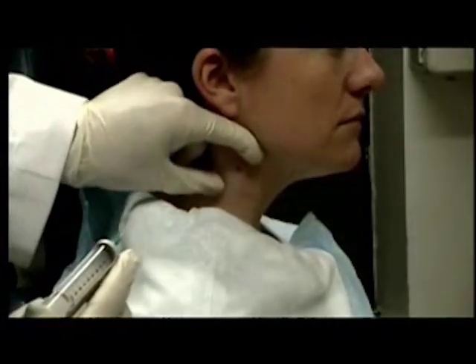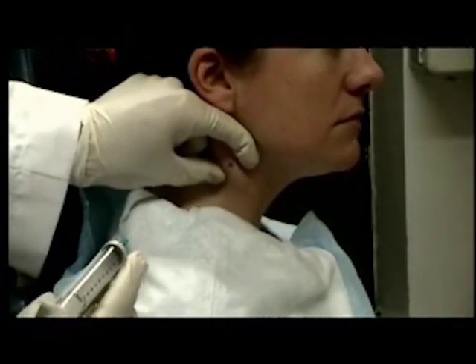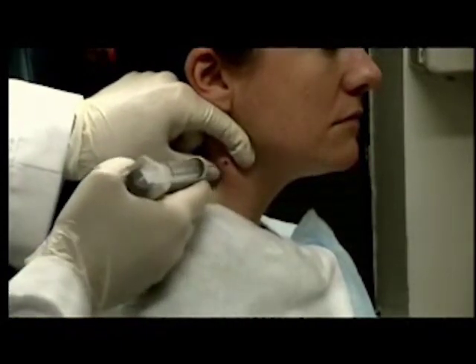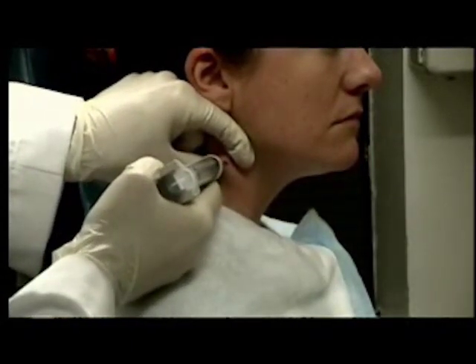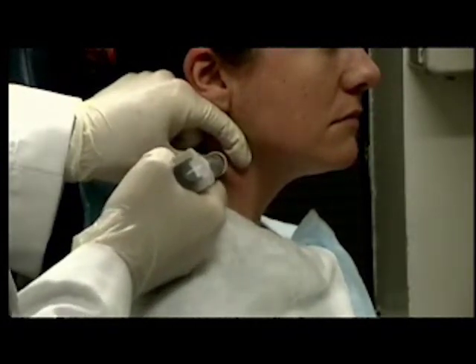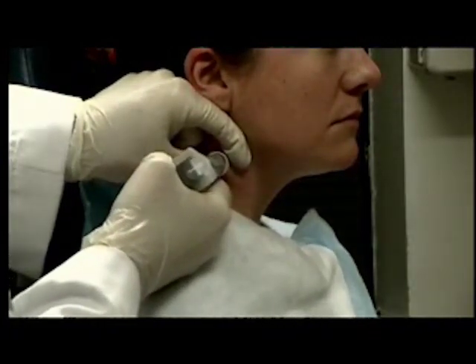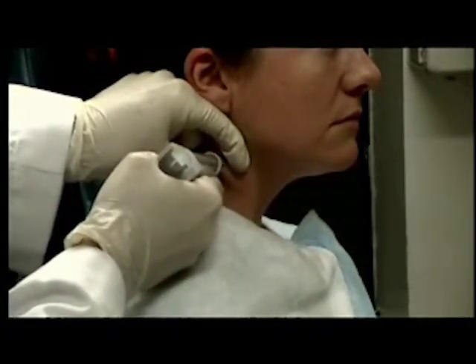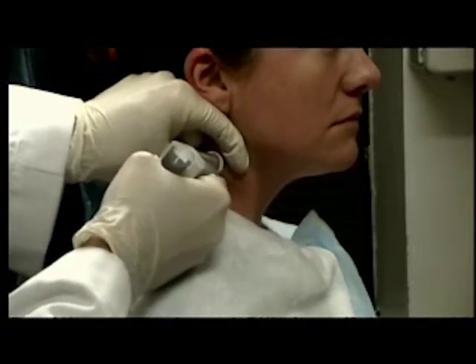I'm going to grab the node between my thumb and forefinger and palpate it. I'm going to take the aspiration device and, without applying suction, I'm going to insert it into the node. I can feel the needle enter the lesion. Now, while applying suction, I'm going to rapidly go in and out of the lesion.